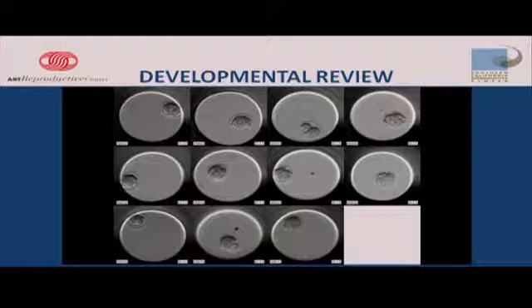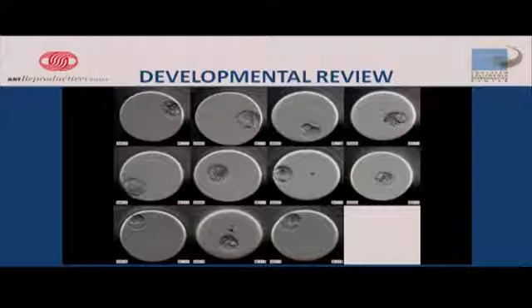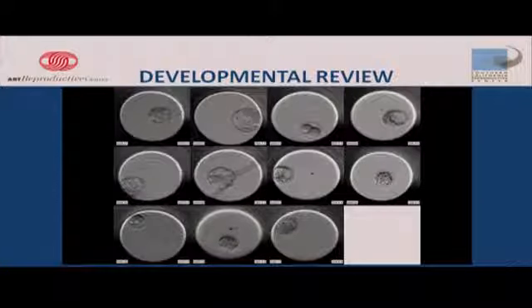We look at these things, and they advance along, and we track every single one every single day, and we look at every picture to see if we can ever catch a problem. We look at this whole set of 11, and we knew which ones were the better developing ones and which ones weren't by analyzing how each one developed across each time point. We then can use what some of the literature has found, and some people who have a lot of time-lapse experience have found out that there's a number of ways to segregate which embryos are the best and such.